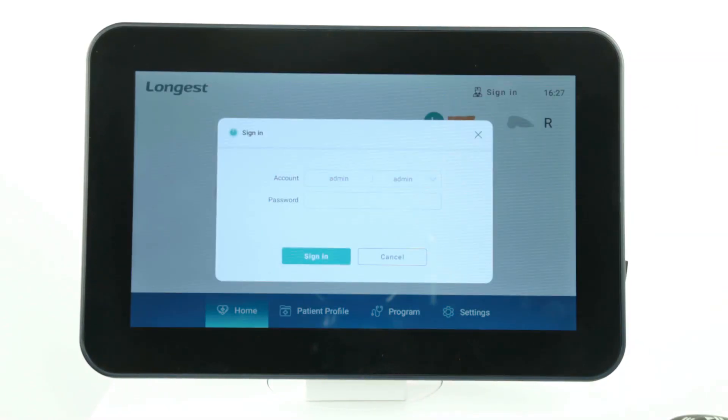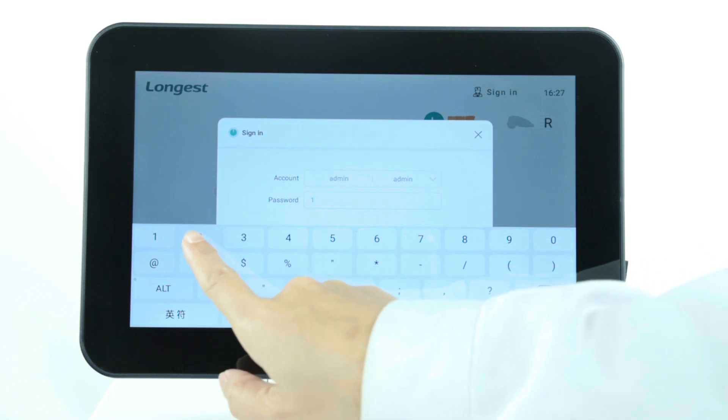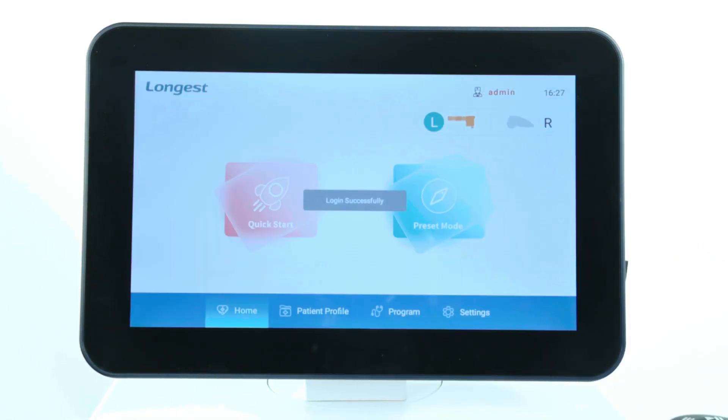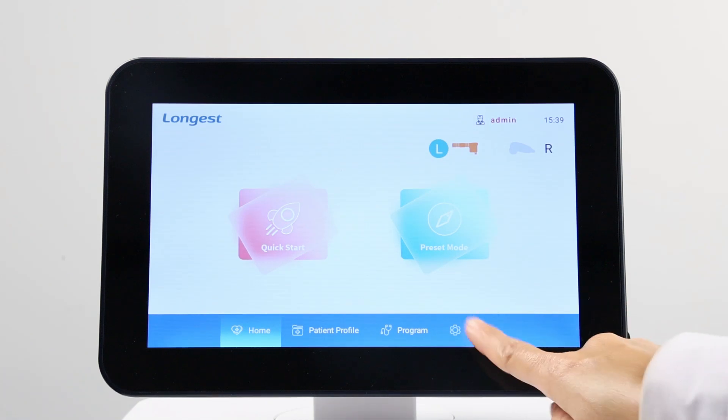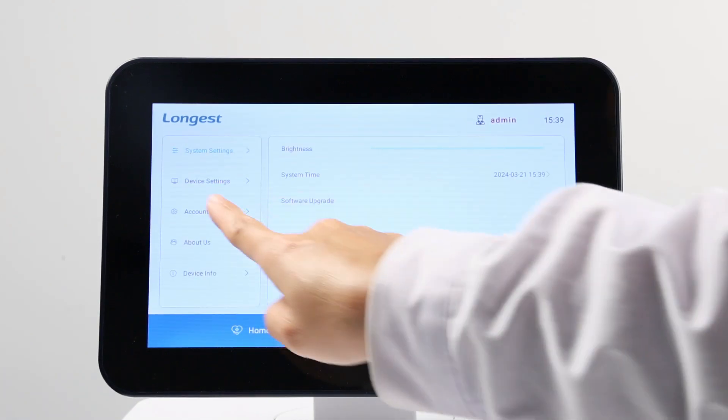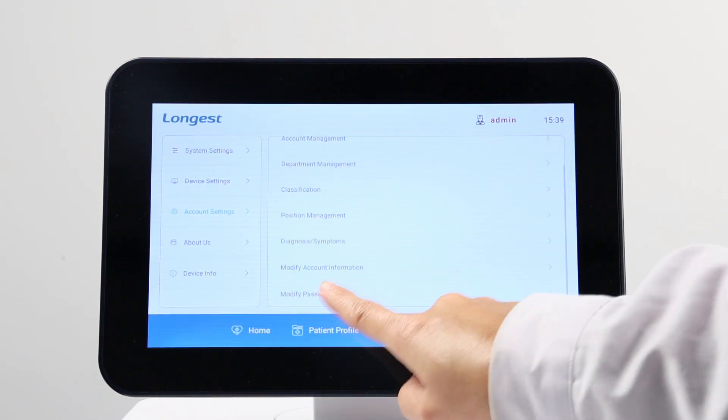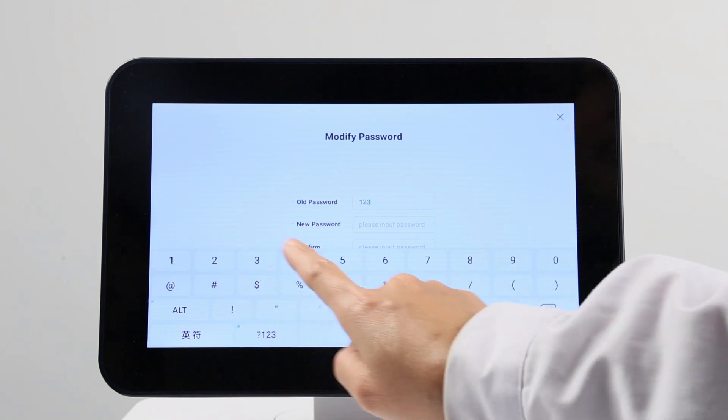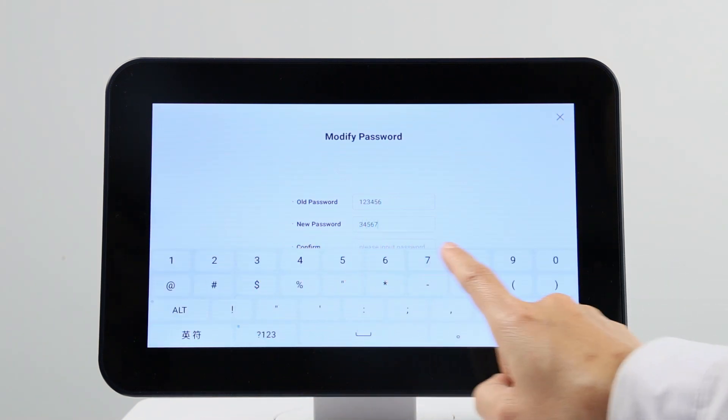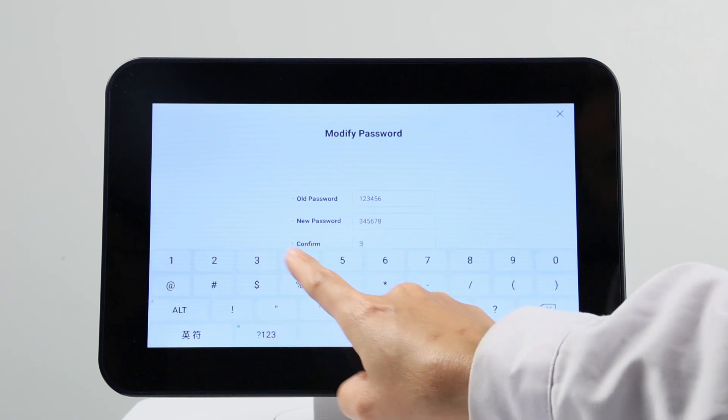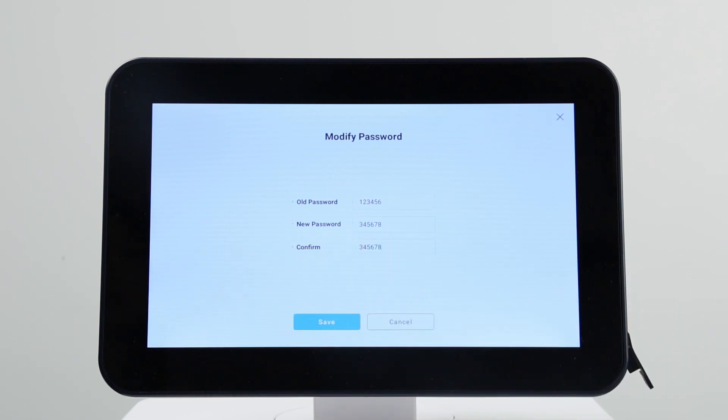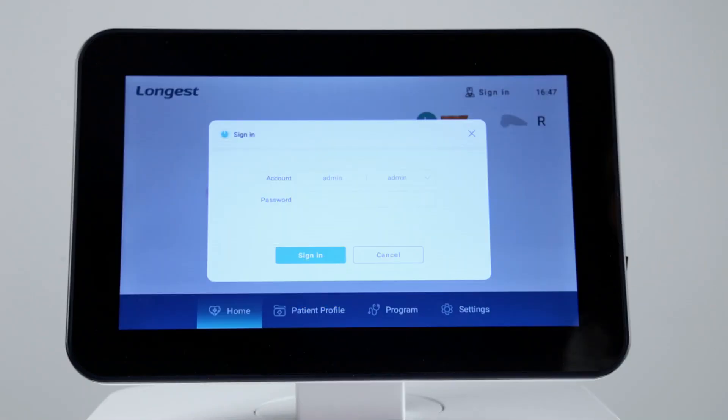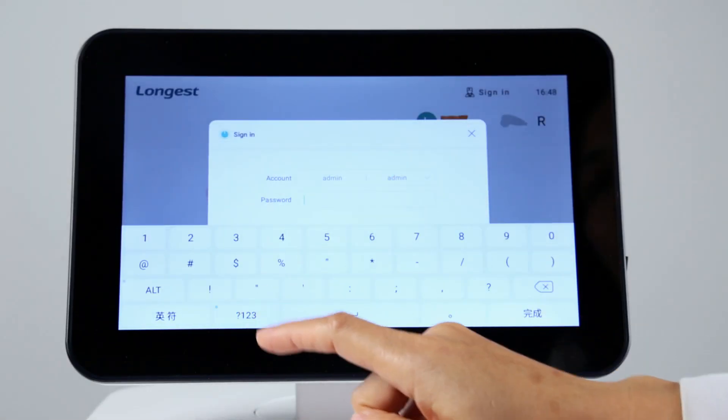The system has a built-in default administrator account. Sign in the account with the given password. To change the password, click settings. Select account settings and find modify password. Enter current password, then enter the new password. Tap save to save your new password. Then you can sign in the account with the new password.